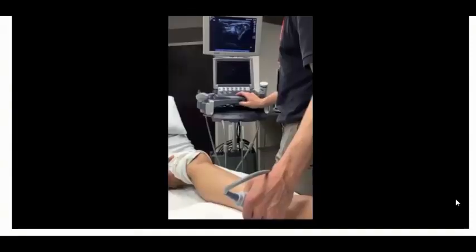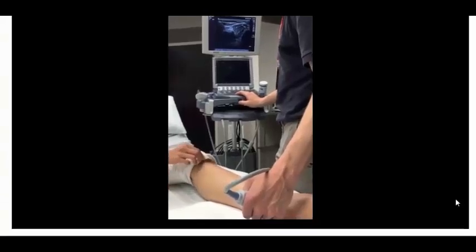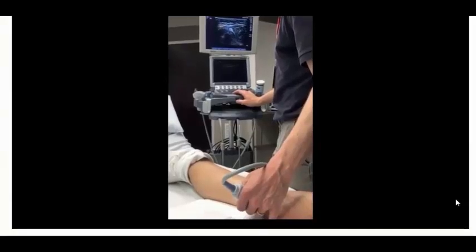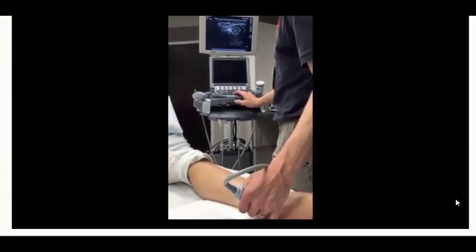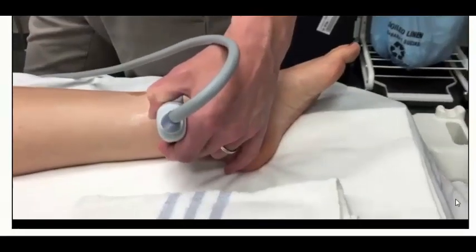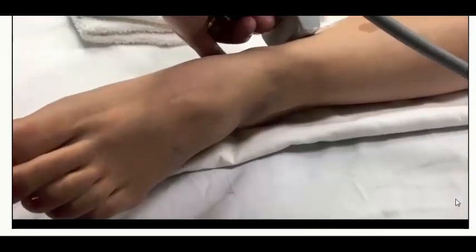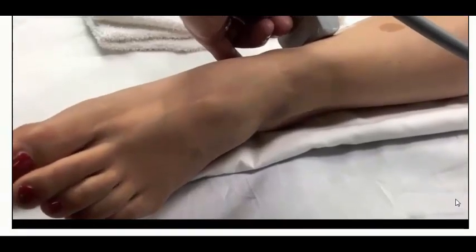To begin the procedure then, recall the structural anatomy of the tarsal tunnel as you obtain your ultrasound views. The patient can be supine or prone. Take a linear probe in a transverse plane across the tarsal tunnel. The vessels are usually identified anterior to the nerve bundle. Fan with large strokes until you see a consistent hyperechoic signal representing the posterior tibial nerve.